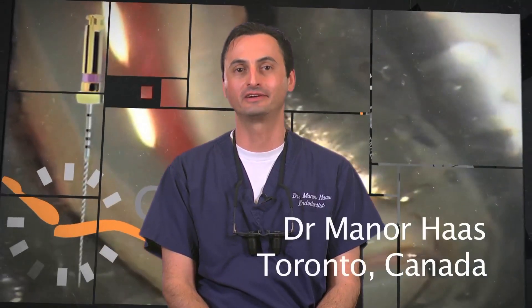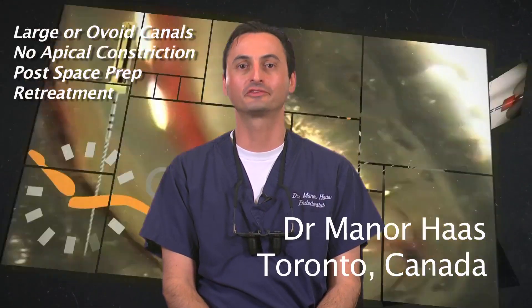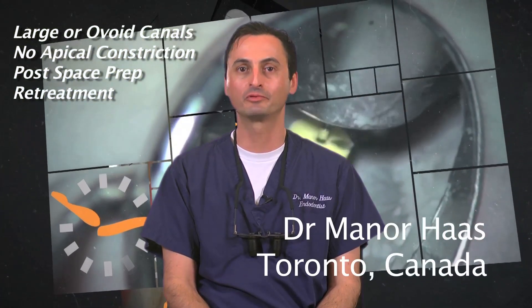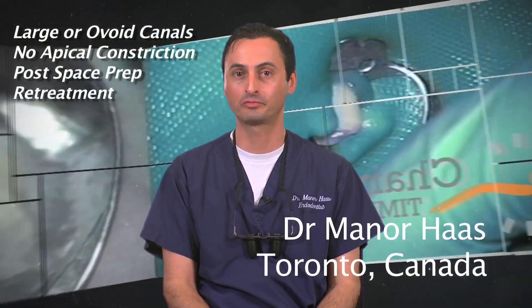Hello, I'm Dr. Menor Haas. I'm a certified endodontist from Toronto, Canada. In this segment, I would like to review the management of large or ovoid canals, canals with no apical constrictions, post-space preparations, and re-treatment of gutta core.